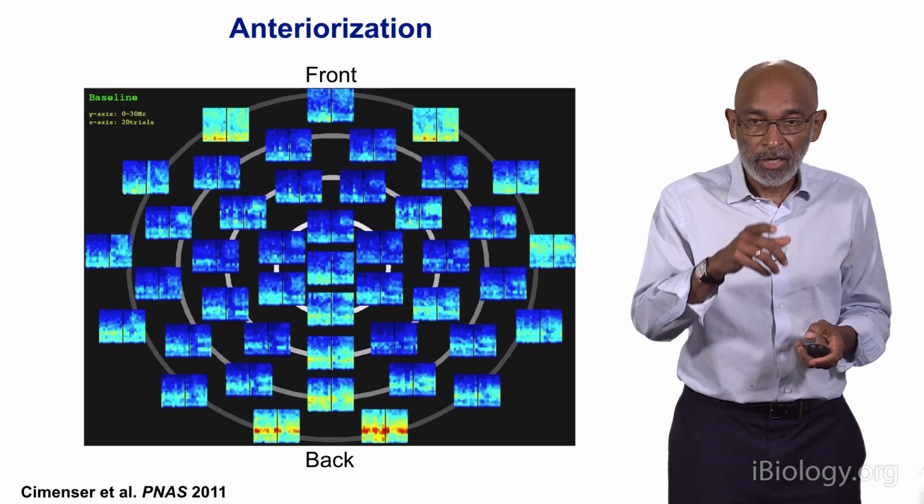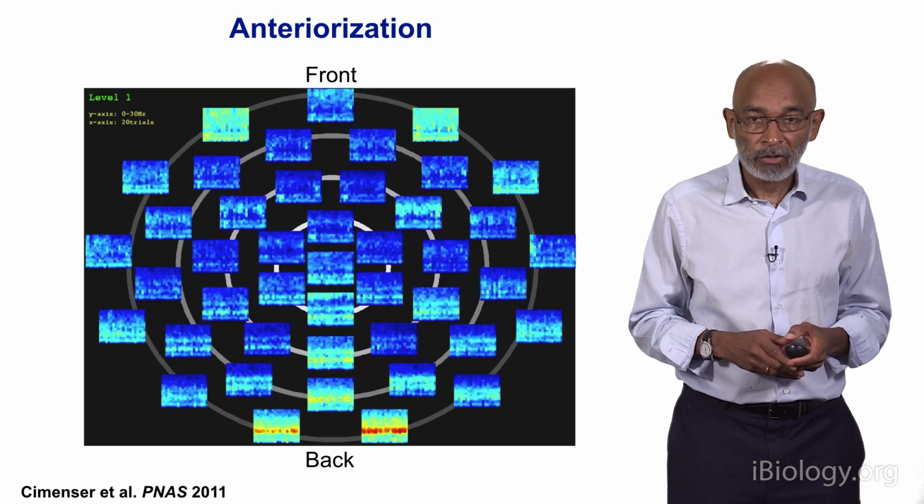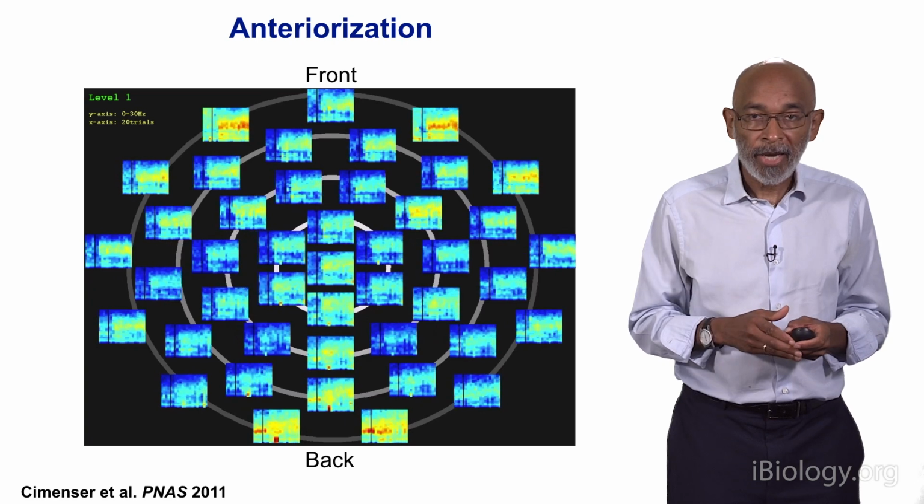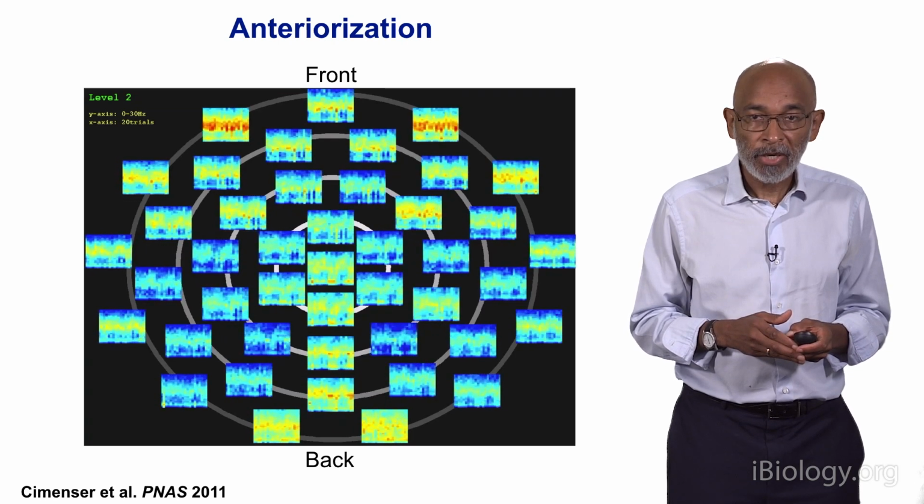So you see the oscillation in the back. The drug infusion hasn't started, it just started. Now watch how it breaks up in the back. See, it breaks up.